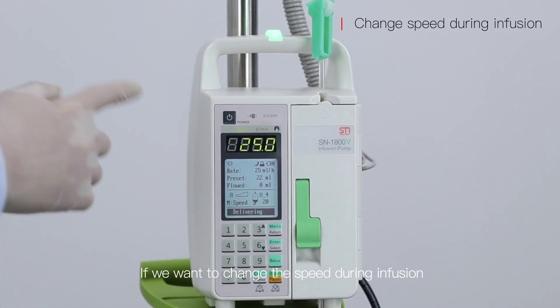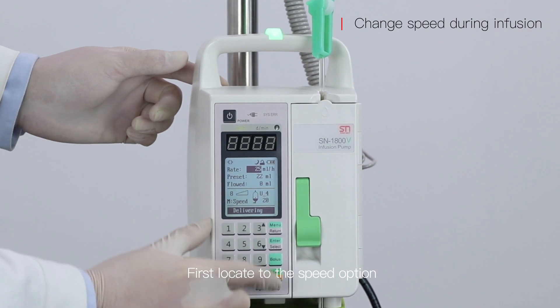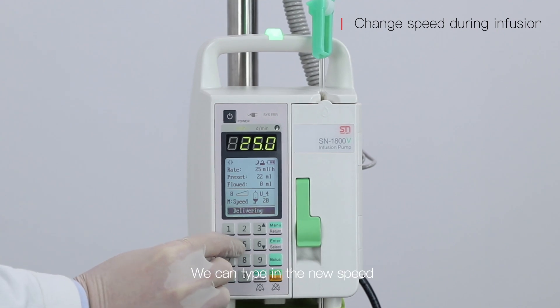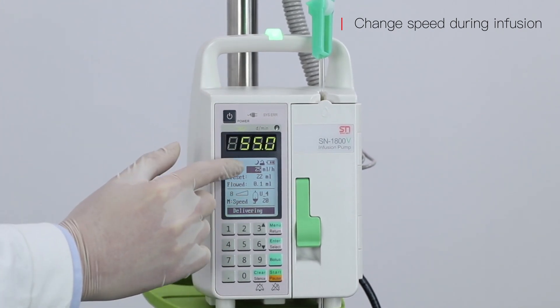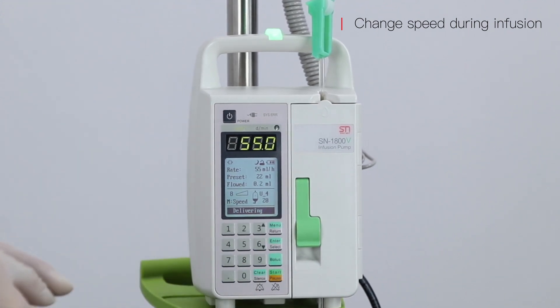If we want to change the speed during infusion, first locate the speed option, then press enter. We can type in the new speed. If confirmed, press enter and it will deliver at the new speed.